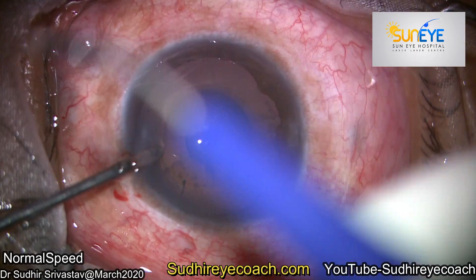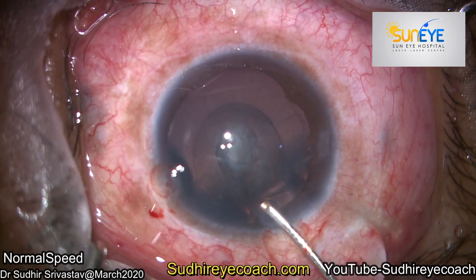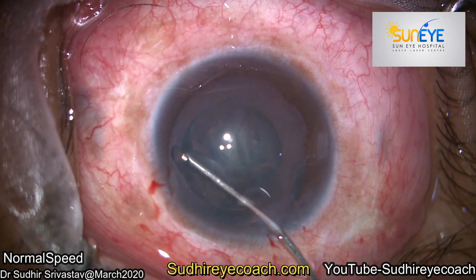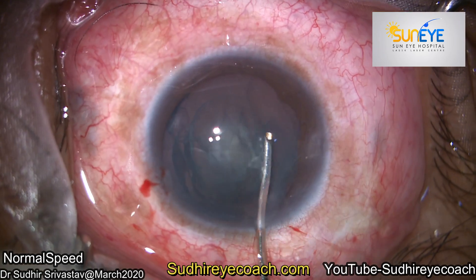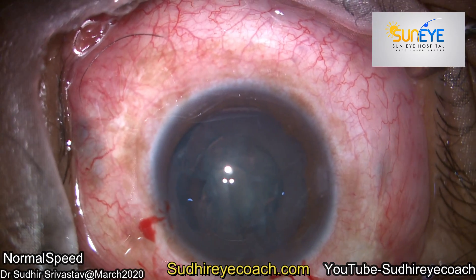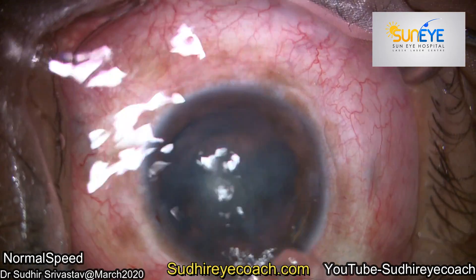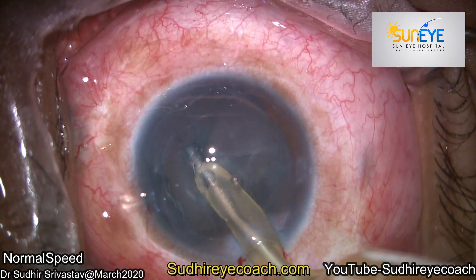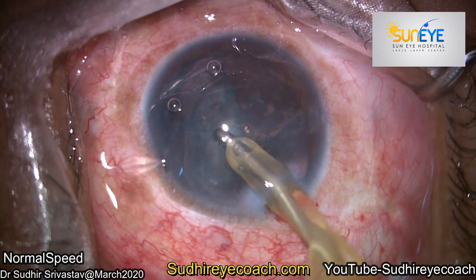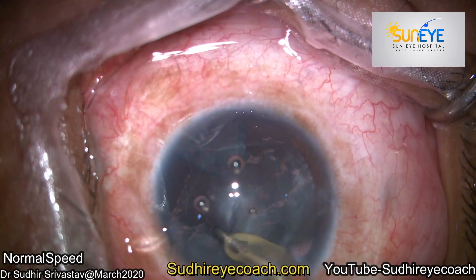Before making the capsular opening, the anterior chamber was cleared from silicon bubbles present in the anterior chamber. Because the patient was young, there was no firm nucleus. Hydro procedures were done to separate the lens matter from the capsule, and the lens matter was planned to be aspirated through irrigation and aspiration. Cortical matter aspiration was done without any problem.